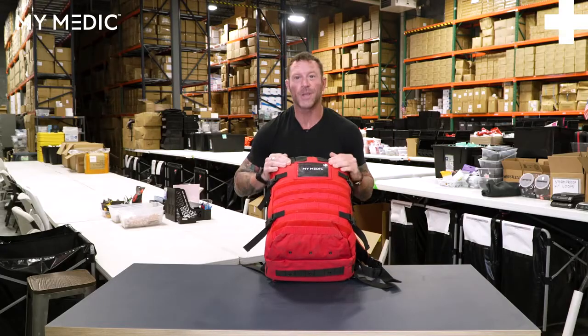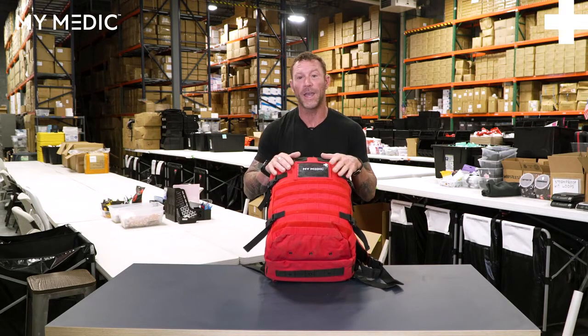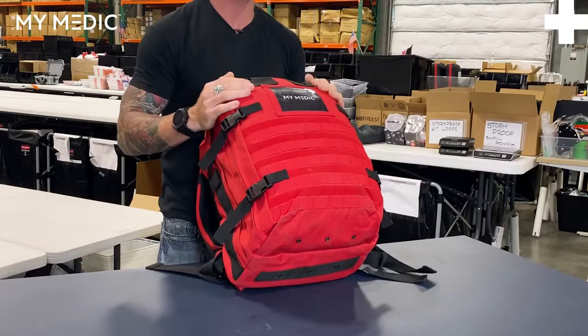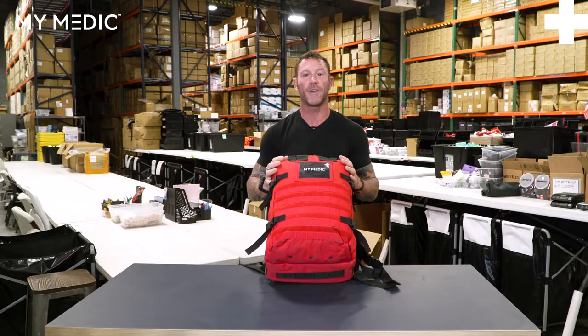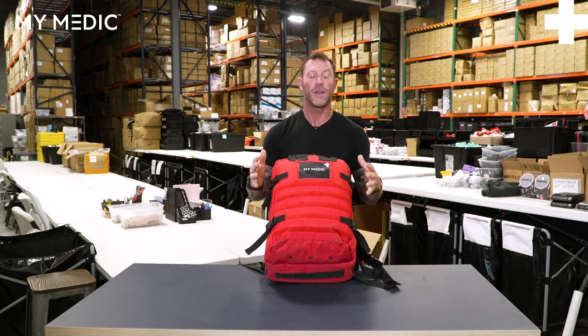What I'm not going to do is unpack each individual item, because we will be here all day and it's going to take up this entire length of this table behind me. But what I am going to do is show you a bunch of cool stuff about the bag — how it all fits together, some of the organization, some of the wayfinding — and you're going to be able to see how much stuff actually goes in here and all the cool stuff that you can do with this bag.